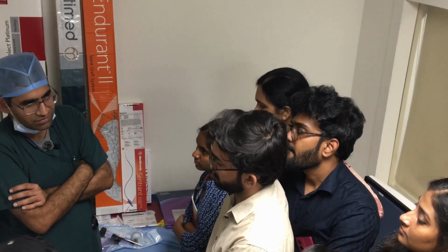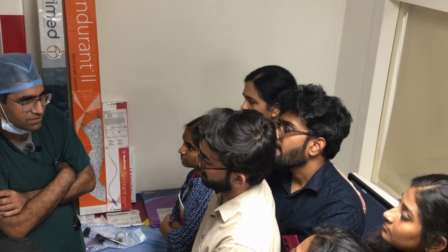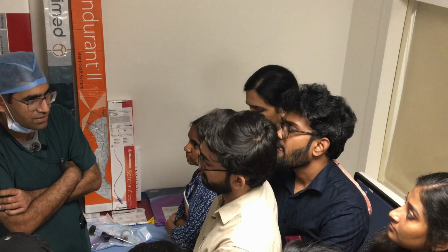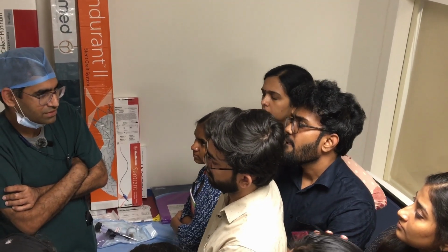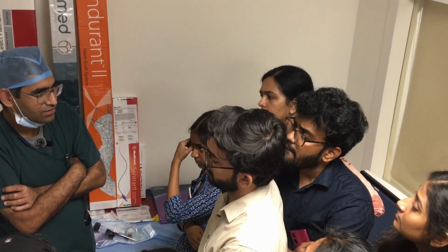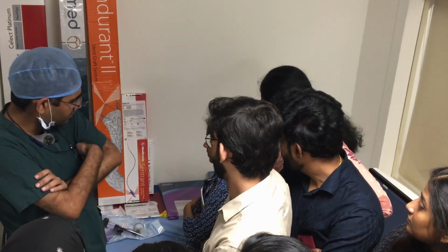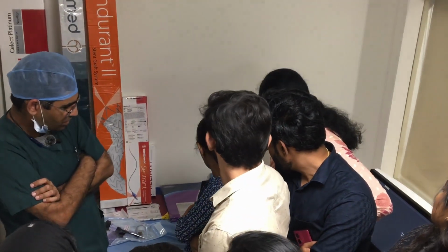It's basically because of the disease we're dealing with. In the aorta, sometimes we use a balloon expandable stent, such as in coarctation, where we need very high precision and want it to dilate to that level. Then we use a balloon expandable stent. And then for the stent, there are many designs.